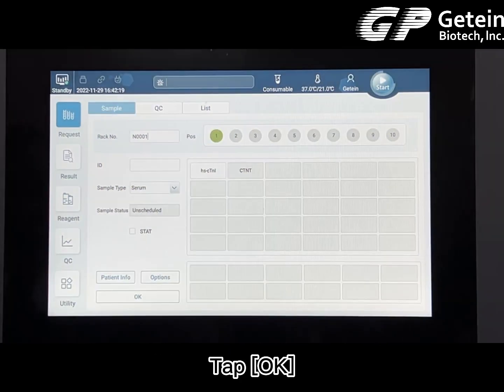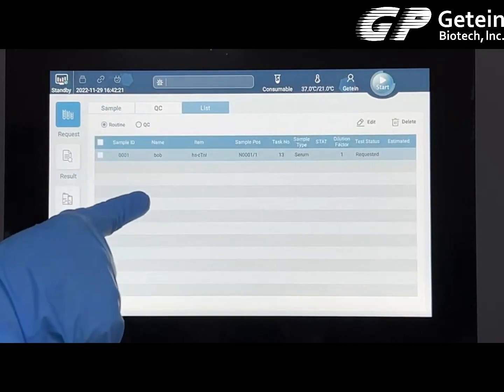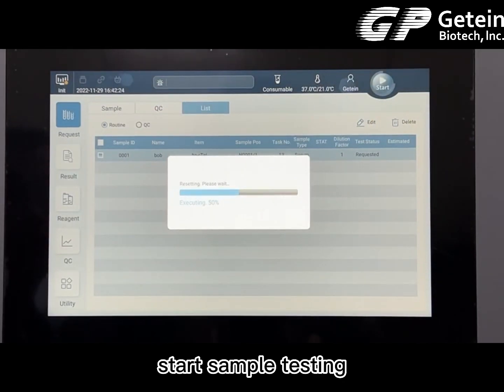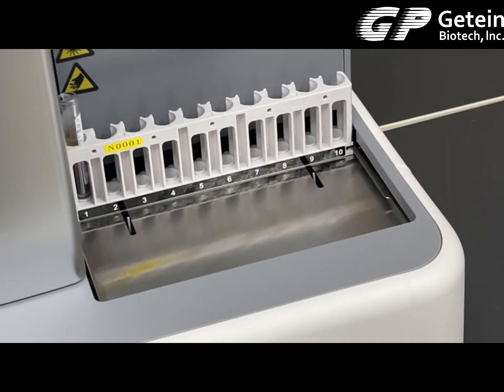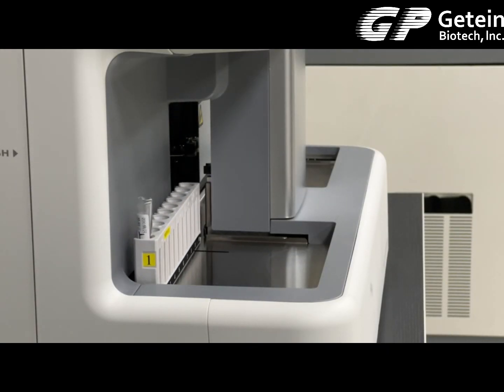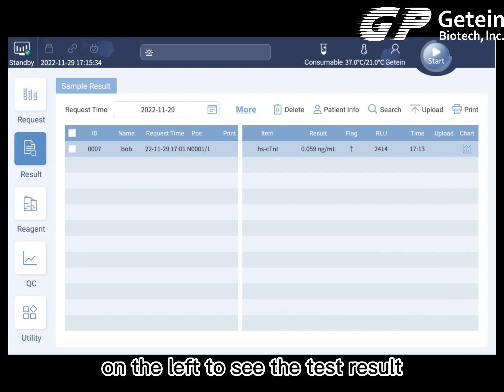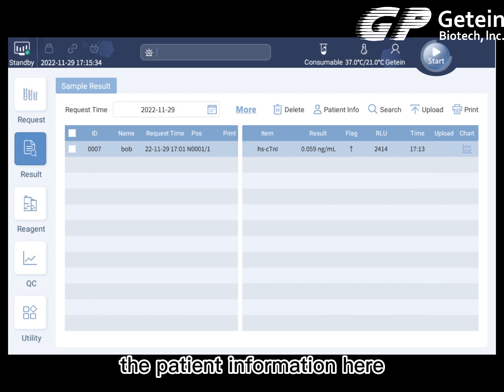Tap OK. The requested tests will be displayed on the List window. Confirm that the information is correct and tap the Start icon in the upper right corner to start sample testing. Tap the result button on the left to see the test results; you can check the result or change the patient information here.